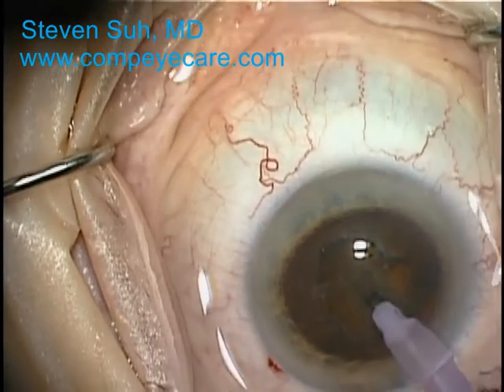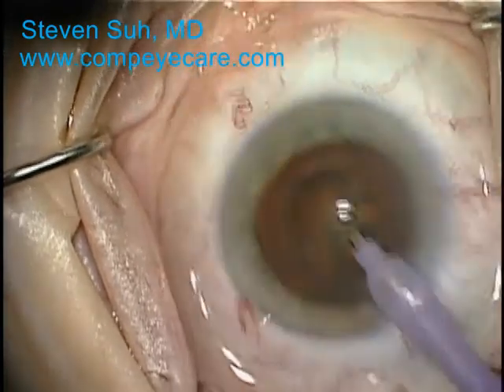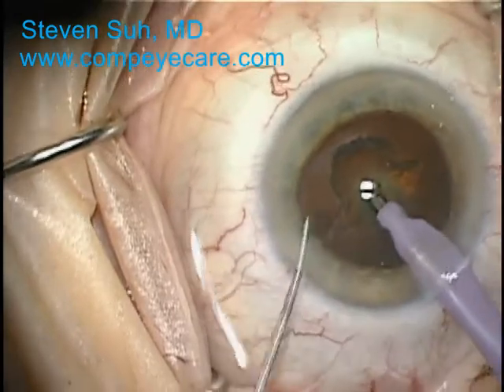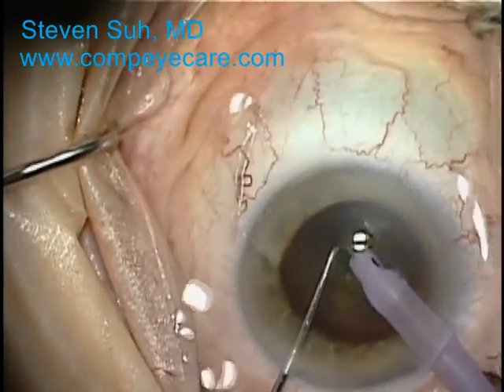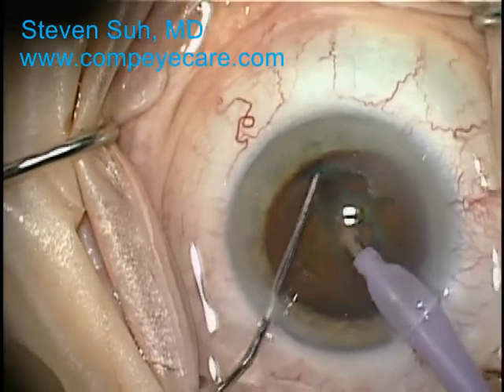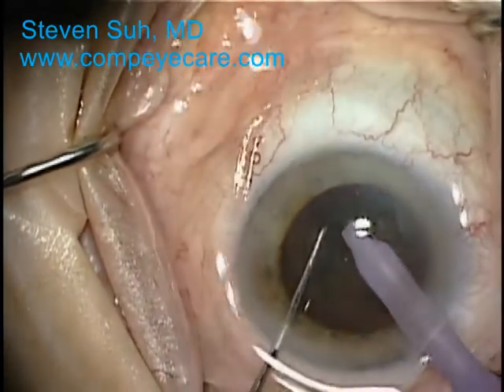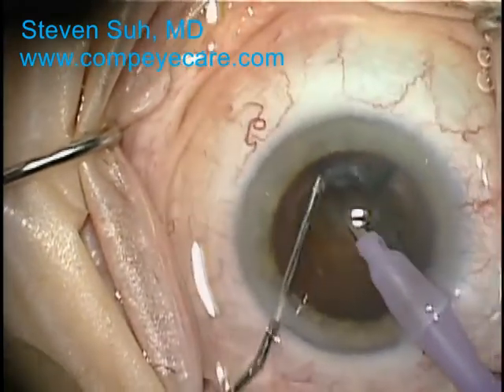This phacoemulsification needle is a hollow tube that uses the ultrasonic phaco energy to vibrate tens of thousands of times per second to break up the lens material and then suck it out of the eye. I first made a groove in the nucleus, which is the densest part of the lens. I then introduced this second instrument called a chopper. By using these two instruments, I'm able to break up the cataract into 4 smaller pieces.